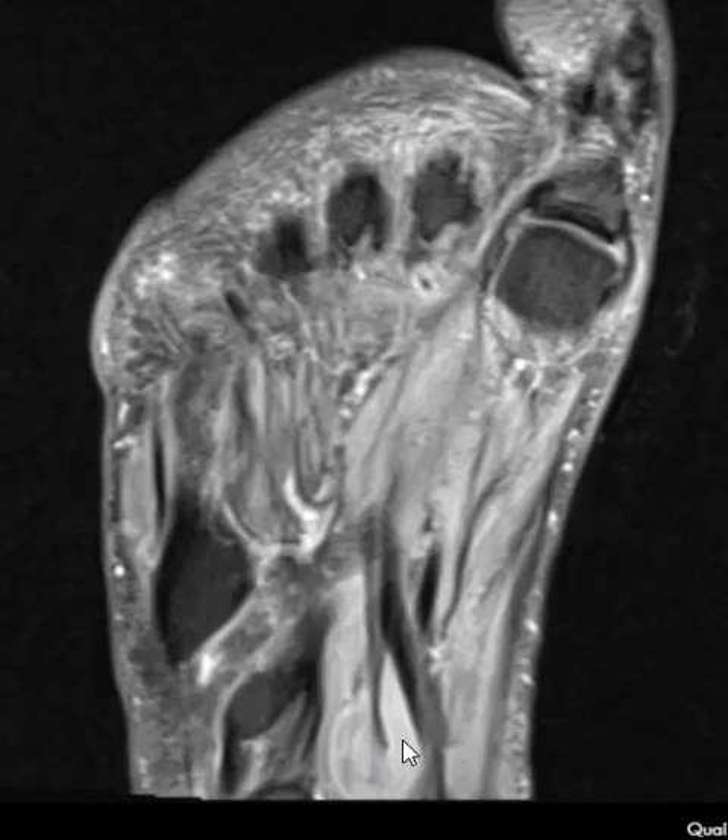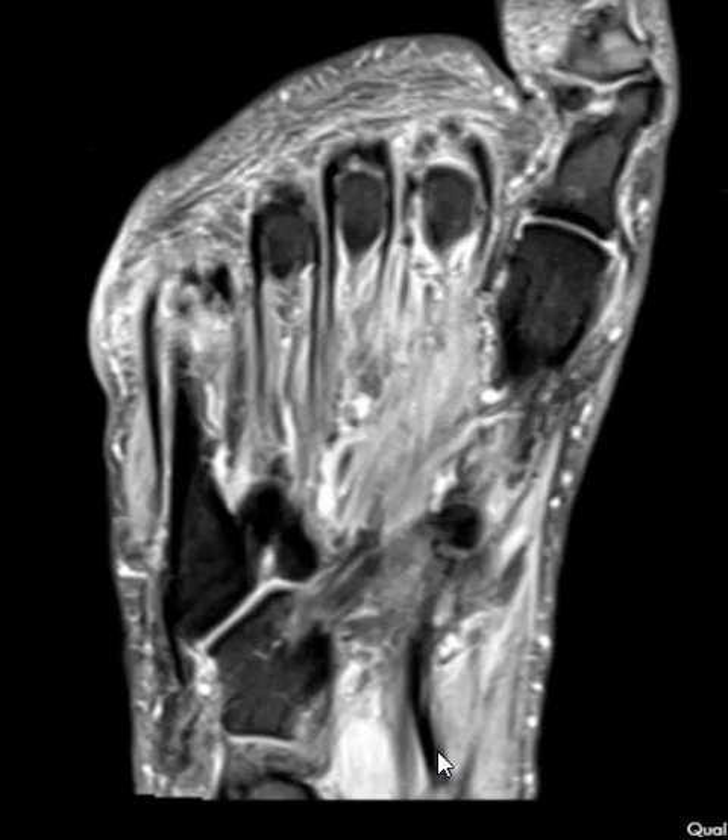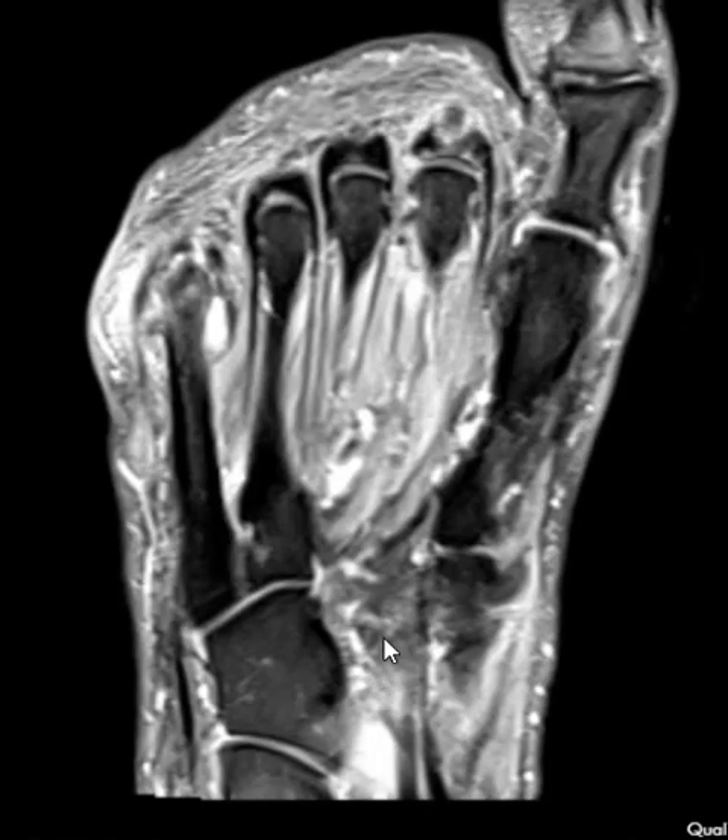Number one, there's a fluid collection down here. This turns out to be at the knot of Henry — the plantar foot is where the flexor hallucis and flexor digitorum tendons cross over each other. Here the flexor hallucis comes over and this is the flexor digitorum; where they cross you get fluid there, which can be from tenosynovitis of the flexor hallucis tendon. Sometimes the ankle joint will have fluid and it can communicate and fill up down here, but this is just an incidental finding.